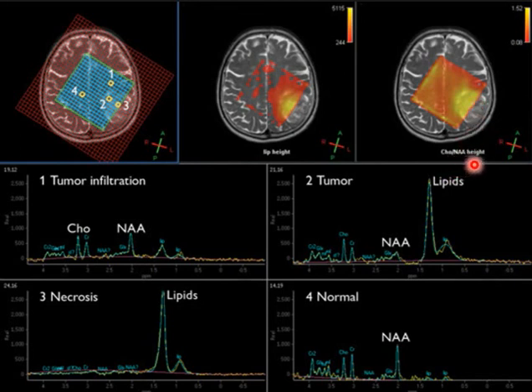Okay, and you can see here in this mapping the map changing the NAA. You can see there is a change in the NAA at the area of the lesion, indicating that neuronal integrity has been disturbed.